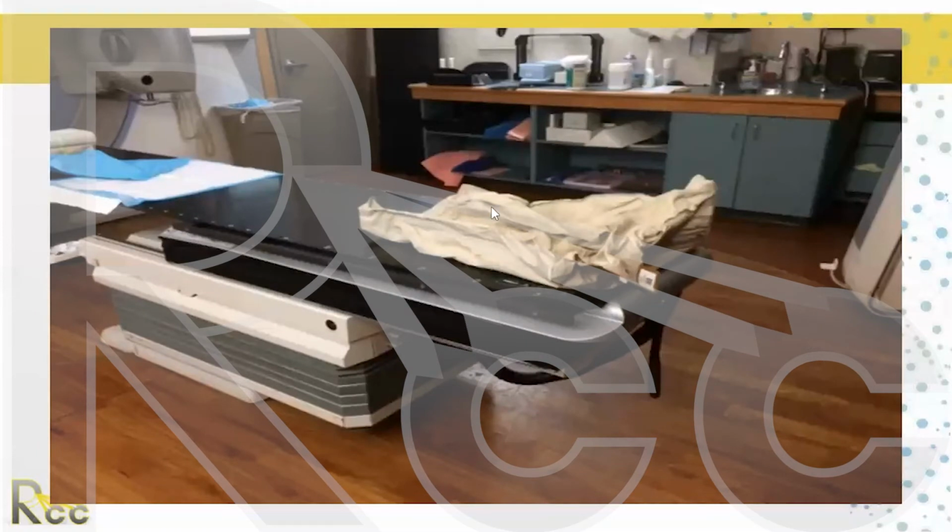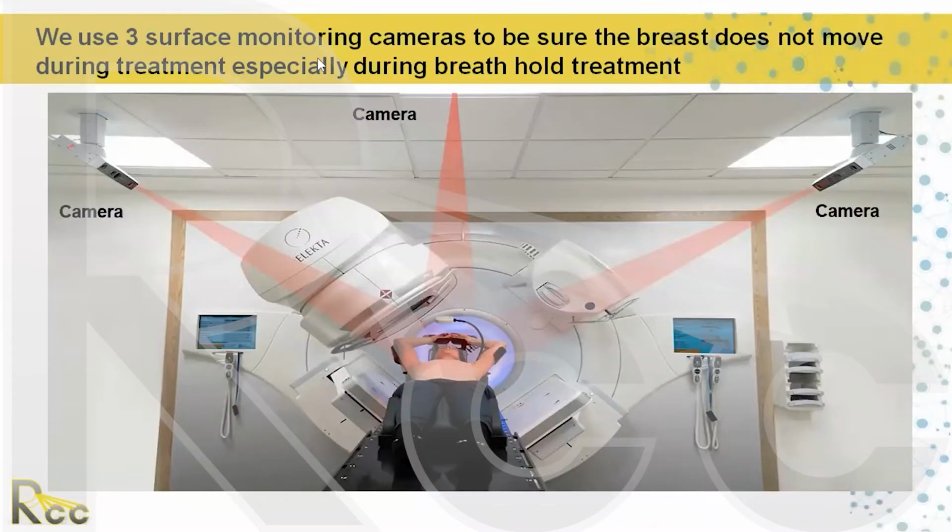This shows it on the table to immobilize the patient's feet. We're treating somebody's prostate, for example, and we want to keep his feet nice and straight. This is customized to his legs and his feet. We have a system here where we monitor the patient's body for movement, and it's called optical surface monitoring, OSM. There is a camera mounted on the ceiling here.